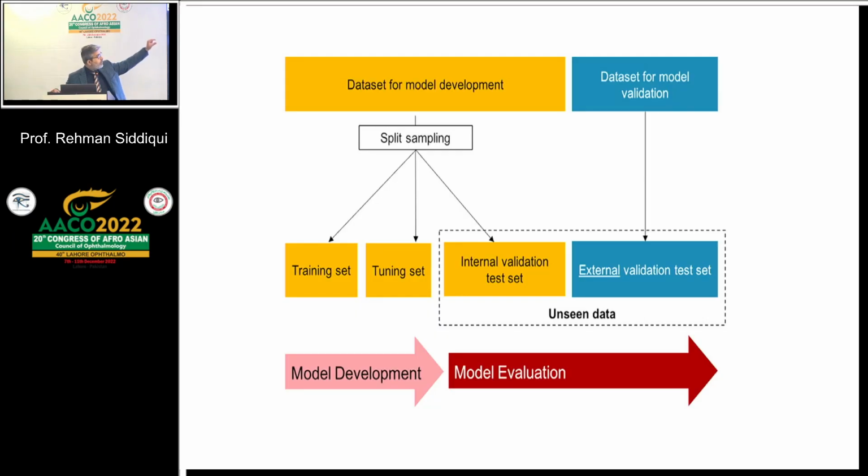It was looking at the label at the top where it says portable. The portable chest X-rays were done on the ward because the patient was too unwell to go to the X-ray lab, and those were the patients more likely to have pneumonia. So instead of picking features from the chest X-ray, it was picking features from the labeling right at the top where it says portable. So it's very important to take that model and actually examine it on patients outside.